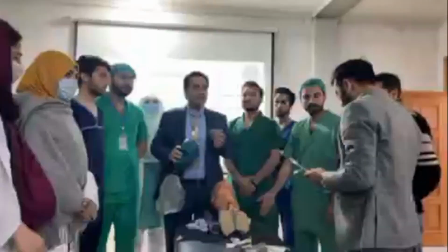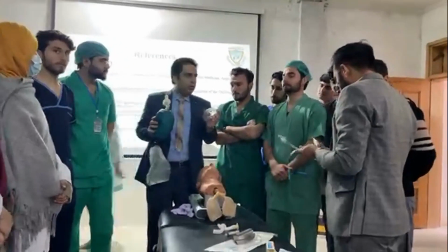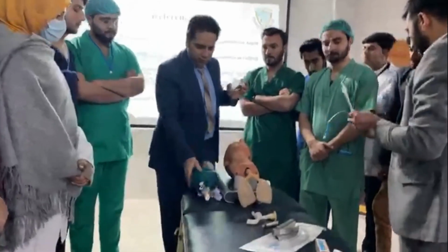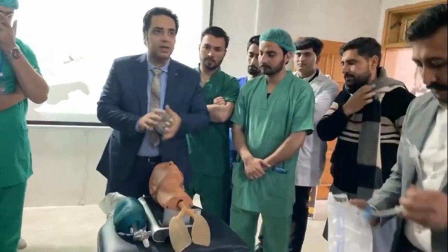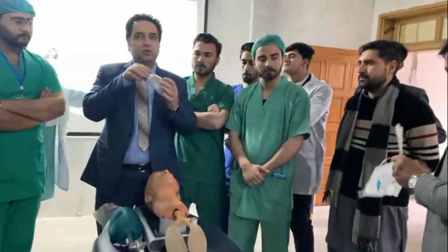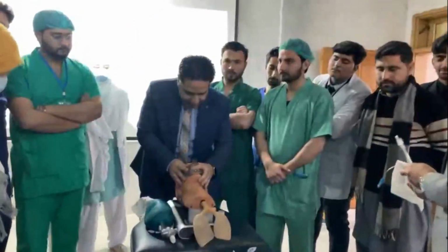They have explained to you earlier the CE technique. When you are alone, you can do a CE technique. First of all, you place the mask on the mouth and the nose of the patient. The broader part goes below over the chin and the shorter, narrower part goes from above. So you place it over here like this.